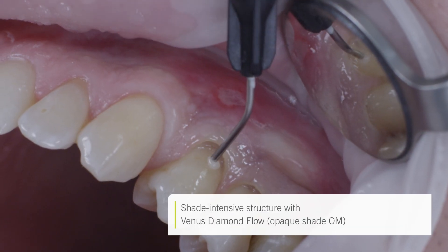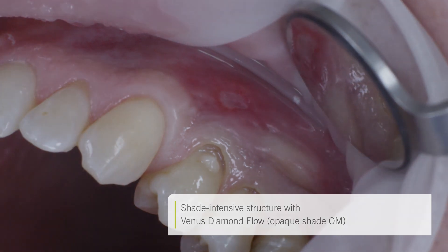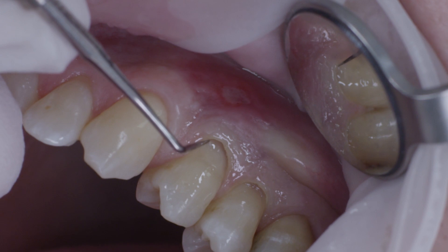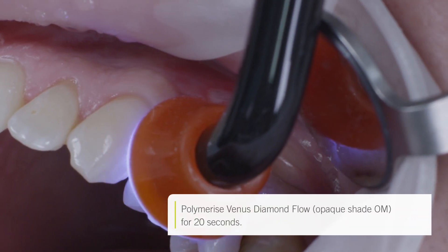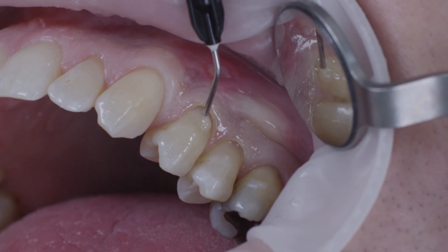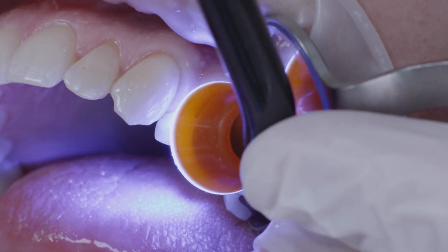On tooth 2-4, I began with shade OM, or opaque medium, of the flowable nano-hybrid composite Venus Diamond Flow. It was placed at the center of the cavity in order to create a shade-intensive structure. Once light curing had been completed, I added further layers of Venus Diamond Flow A3. Using the probe, the material was carefully adapted to the preparation margins and light cured accordingly.